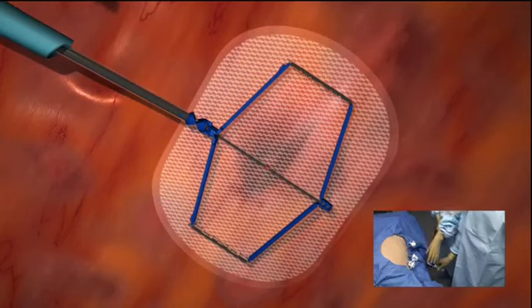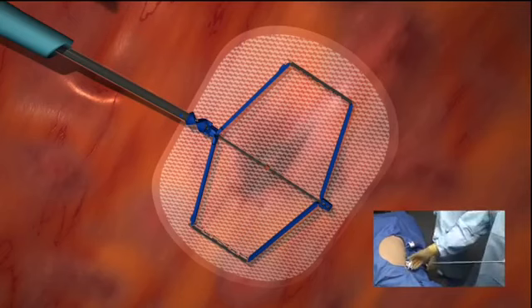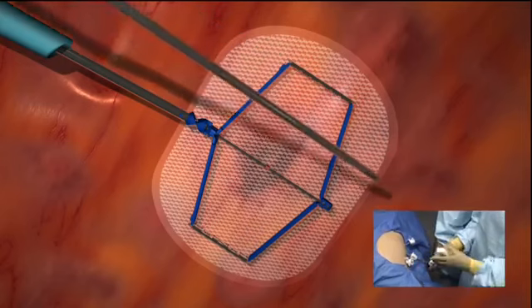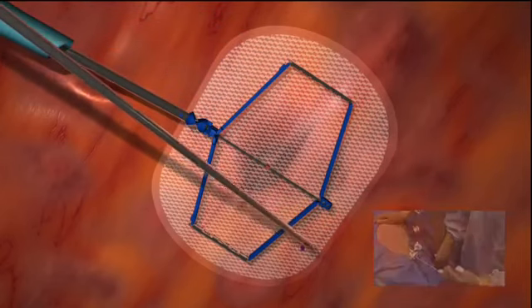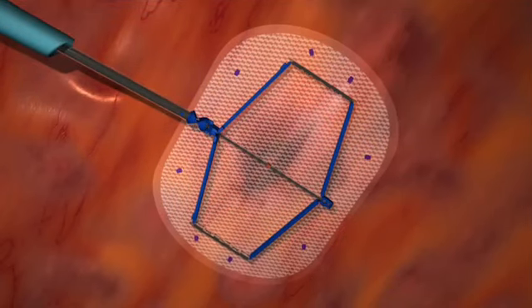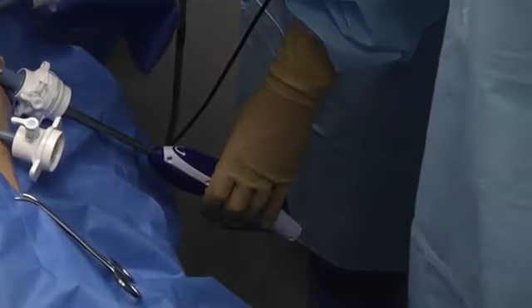Fixate the mesh to the abdominal wall using AbsorbaTack or ProTac fixation devices. Place 8 or more tacks around the outer perimeter of the mesh prior to detaching the frame. It may be helpful to place additional tacks where the transfascial sutures will be placed. Remove the tacker and hand off the device.